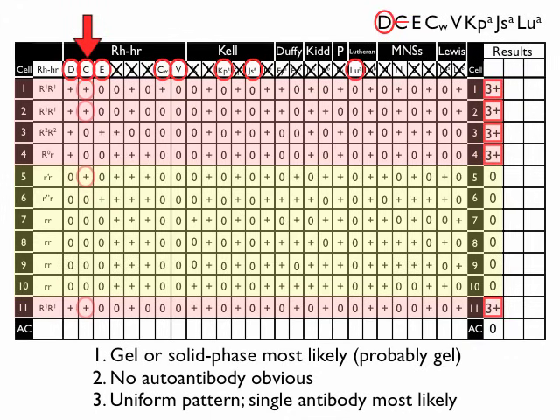Okay, great. Let's move on and let's look next at big E. Is big E a possibility? Again, where is it present? It's only there in 2 cells. Again, it certainly wouldn't explain every reaction, and there's no reaction in one place where it's present. So it's probably not big E.